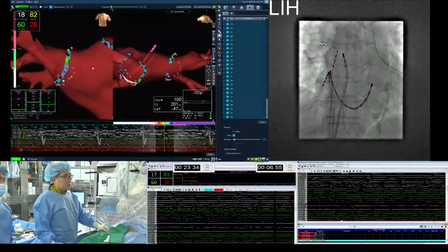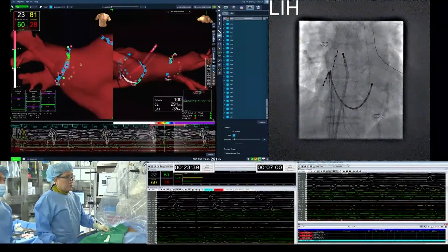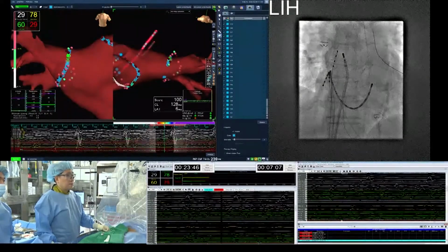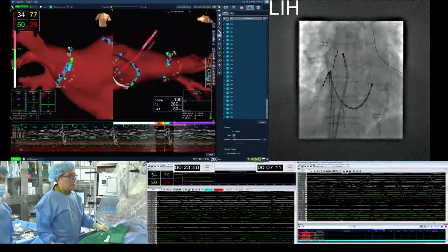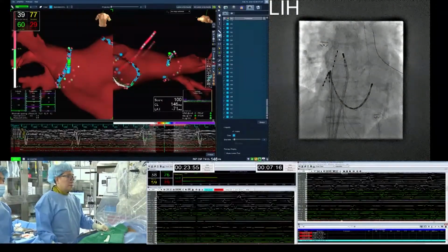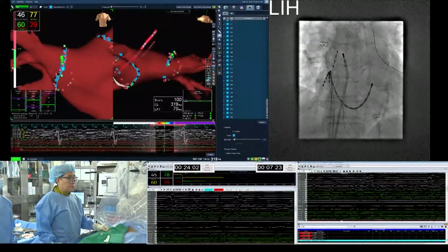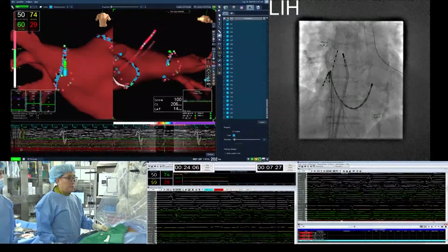It's very dangerous. This sphere suggests the impedance drop and the location of the ablation site. It is quite useful for safety. I don't trust the color change 100%, but at least if the color changes to chocolate color, that means there is some lesion formation, and if you give more energy, there is a risk of complication.